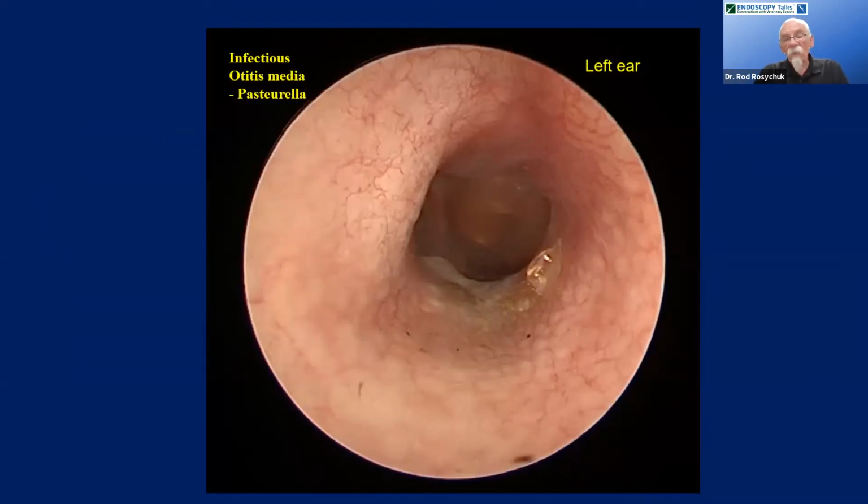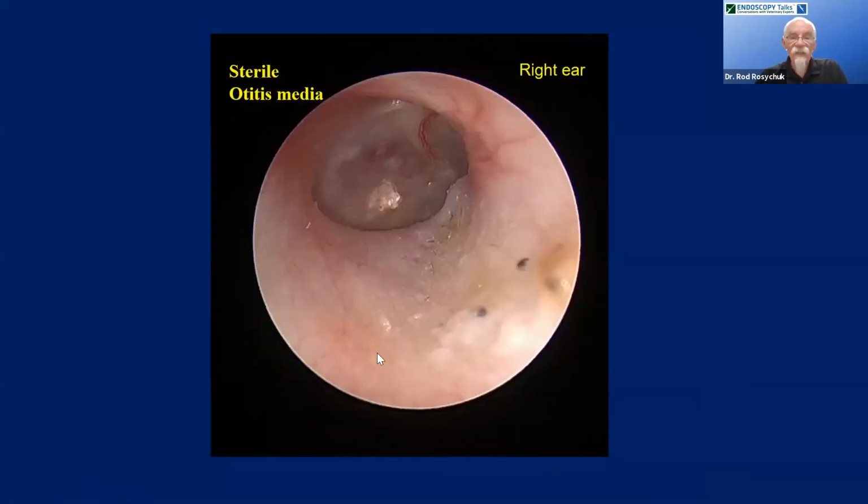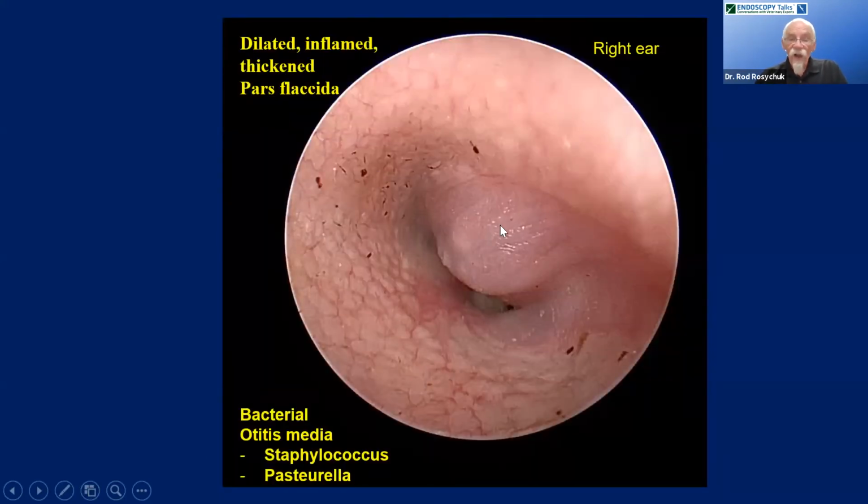Where do we see this intact tympanum with suspicion of otitis media? Probably more so in cats actually than dogs, with otitis media, otitis interna. In this cat, good examples, pathologic tympanum right here. This cat, very opaque, somewhat neovascularized. Another cat with otitis media, intact tympanum, very opaque, neovascularized. Cat with a dilated pars flaccida, and I can't see the pars tensa here. Don't see that very often, but this is all intact, all related to otitis media in these kitties.